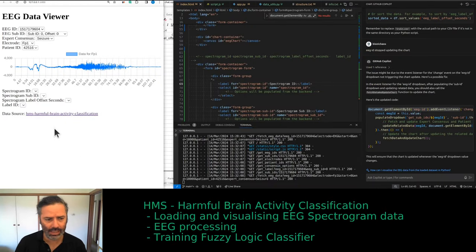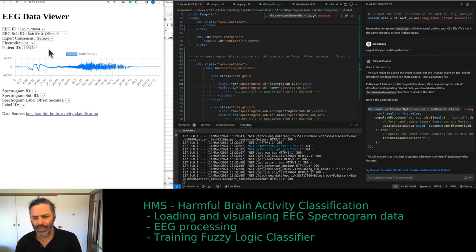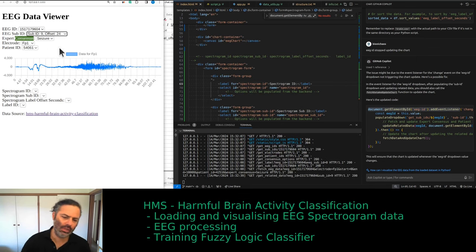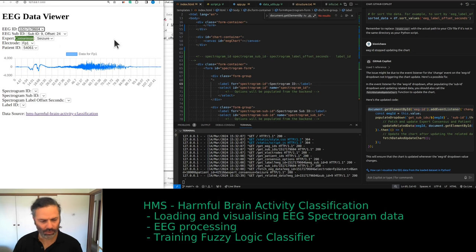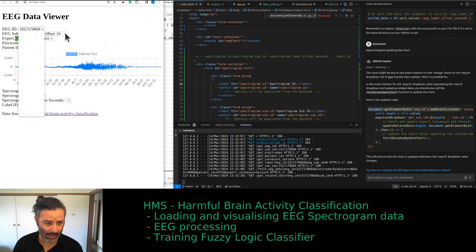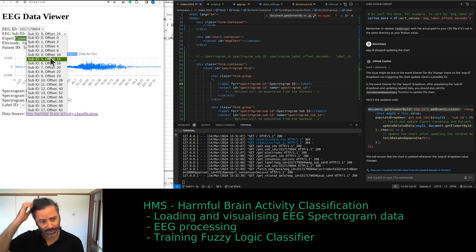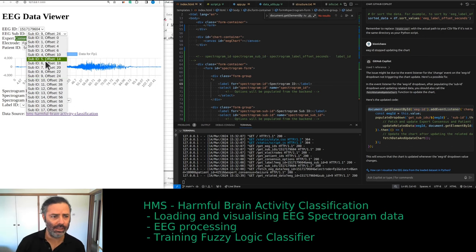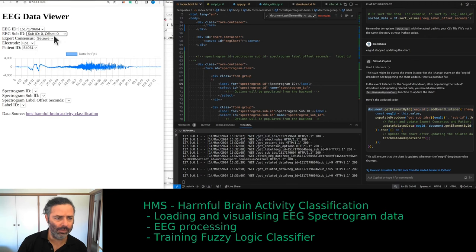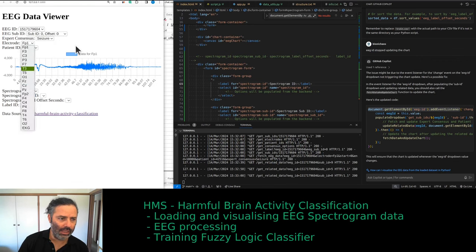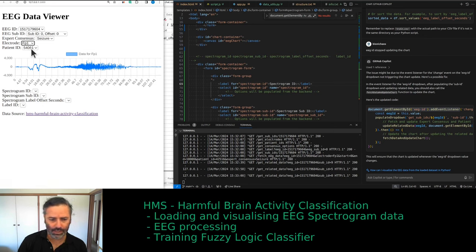We have all these other labels along with the actual label. The idea is: by default when you load the page, an EEG ID is preselected, but you can select a different one. Selecting the whole EEG ID shows the whole recording, while selecting the sub ID shows just the 50-second window. Default will be sub ID 00, since some EEG IDs don't have extra sub IDs. A default electrode will be selected and the patient ID will also be displayed.